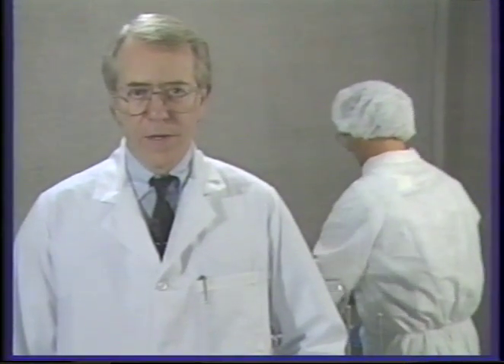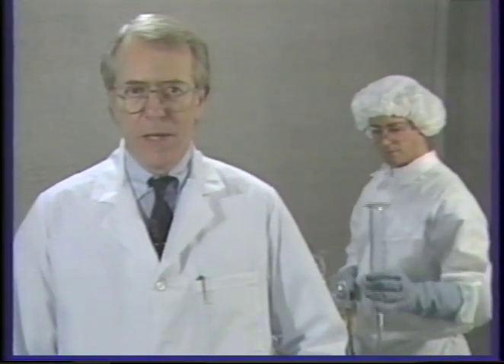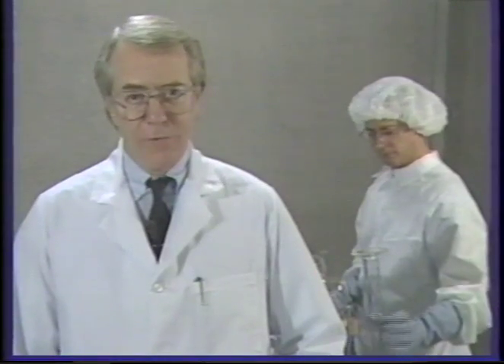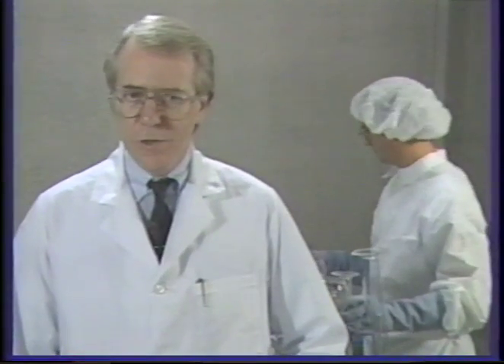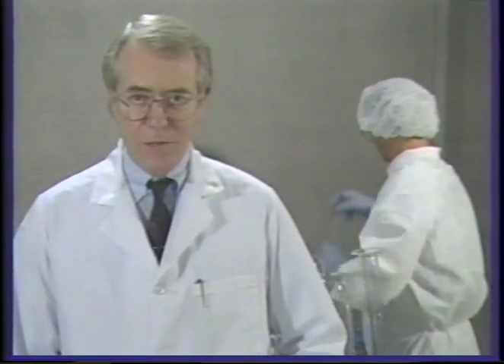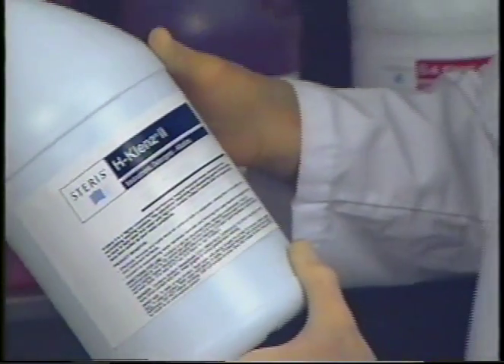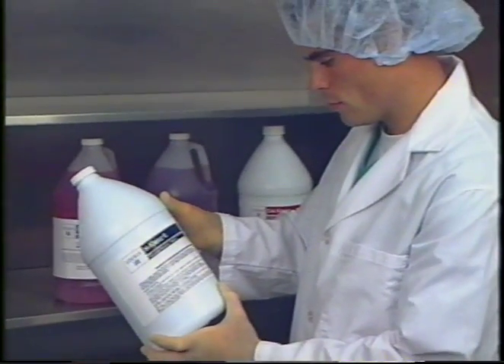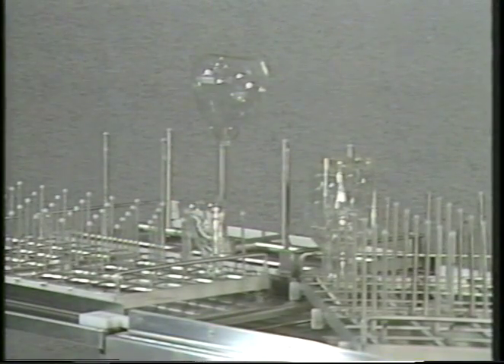Knowledge of forces involved in the deposition and binding of soils on contact surfaces and how best to clean them is highly technical and often causes conflicts when attempting to clean many different types of devices at the same time. The best insurance against mishandling of equipment and devices is to pre-sort devices prior to cleaning and to then check with the manufacturers of the products for washing instructions prior to using them in your department. Washers that offer multiple accessory manifolds can accommodate multiple types of baskets and glassware, thus reducing load accumulation and increasing cleaning throughput.